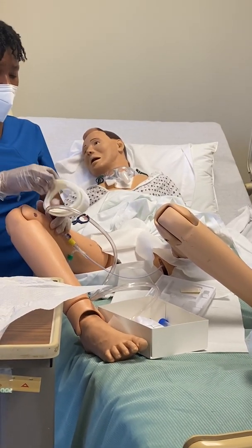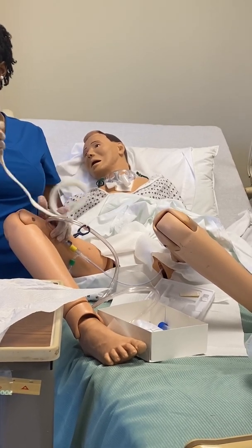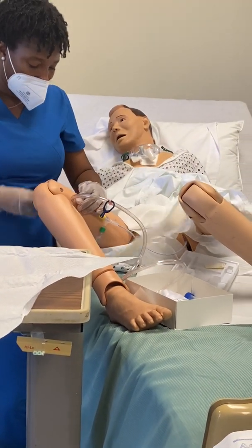Give me that. The right, yeah. This is a catheter strap. Don't worry about anything like this. If you're doing a catheter, if you're doing your comp, just tell me you're going to tape it to the leg because you won't always have one of these anyway. Okay?